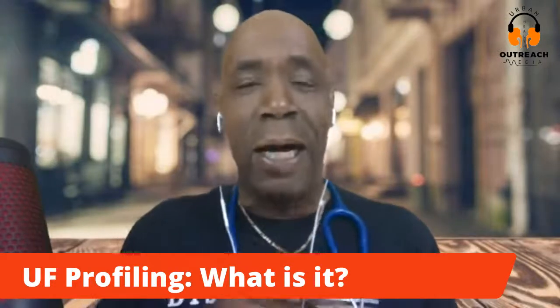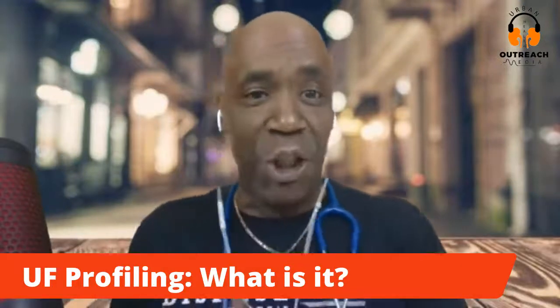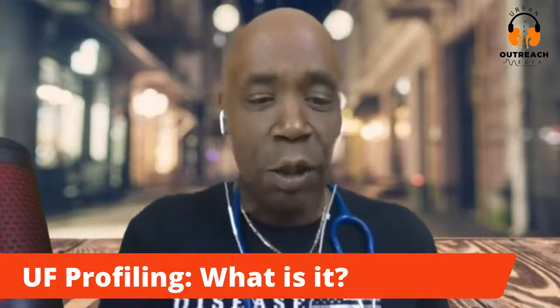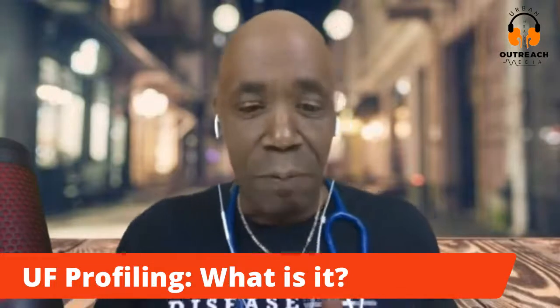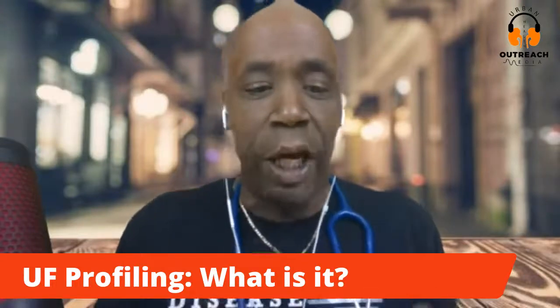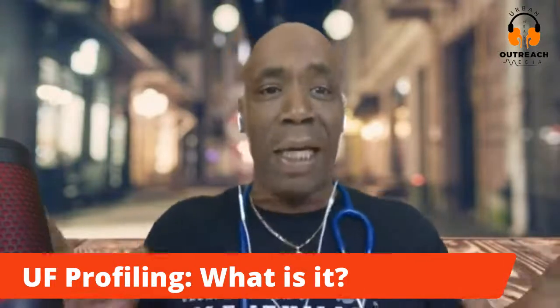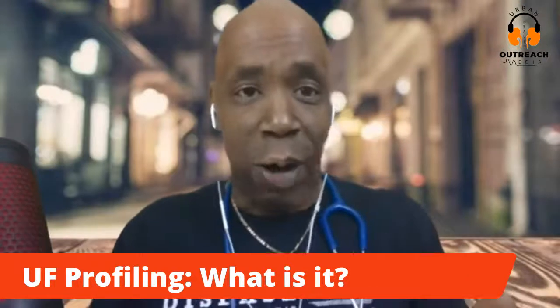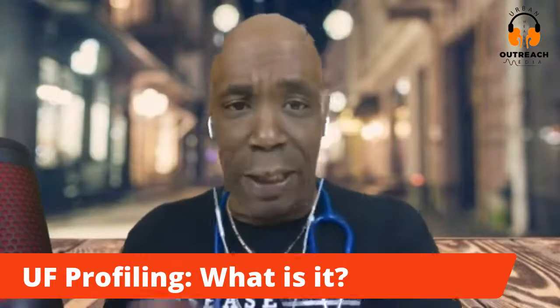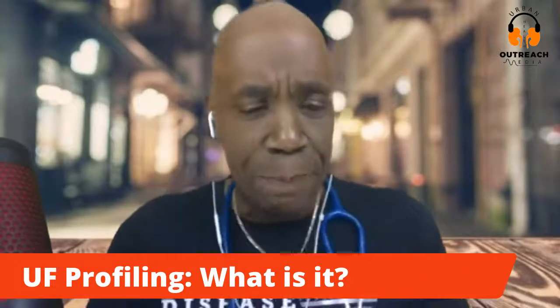If you're a warrior veteran and you've been at dialysis, you may have heard the term UF profile, which I just showed you on the screen in that picture, used in the hemodialysis facility, or seen it on the graph or on your machine. Why is it used? For some patients, UF profiling can help decrease periods of low blood pressure, especially toward the end of treatment. You may hear a lot of patients say they start cramping or their blood pressure drops maybe 30 minutes before treatment is about to end, maybe an hour. You commonly hear this a lot.